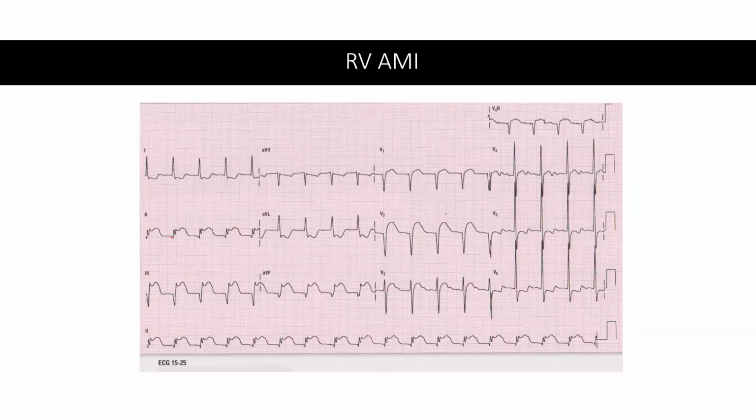Okay, so if we take a look over here, how many millimeters is it? 1, 2, 3, around 3. How about in lead 3? 1, 2, 3, 4, right? So which one is taller as far as ST elevation is concerned? Is it lead 2 or lead 3?